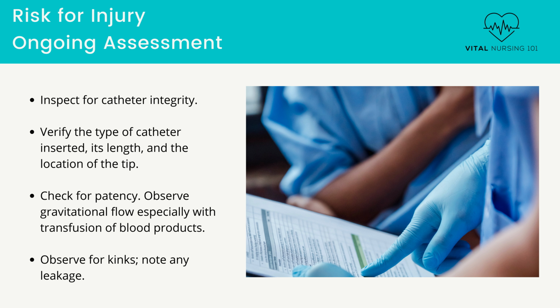Verify the type of catheter inserted, its length, and the location of the tip. This assessment can be done by review of documentation in the patient's medical record and confirmation by chest X-ray study. Newer catheters may utilize magnet tip locators or electrocardiogram verification.